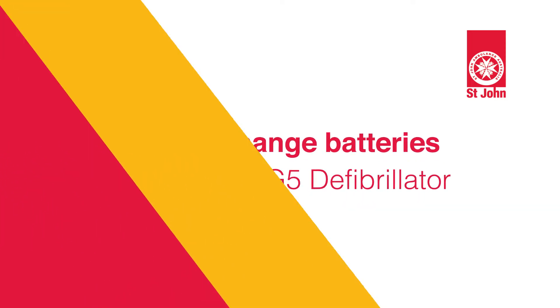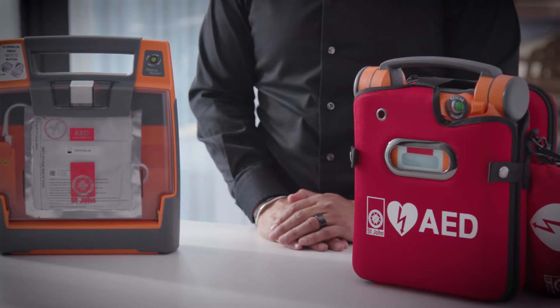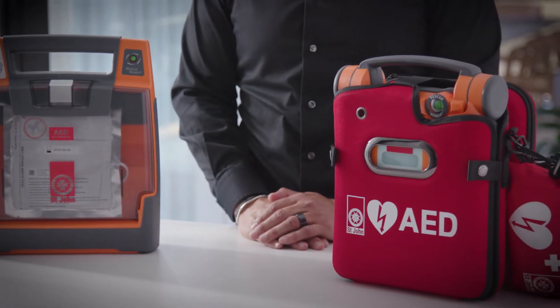Hi, in this video we'll walk you through how to change your battery on your St. John G3 Elite and G5 defibrillator. Many defibrillator failures are due to a flat battery. That's why it's so important to know how and when to change your battery.